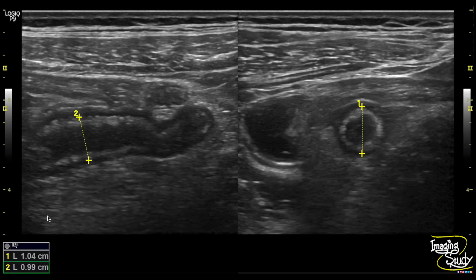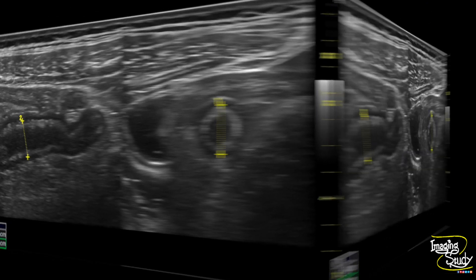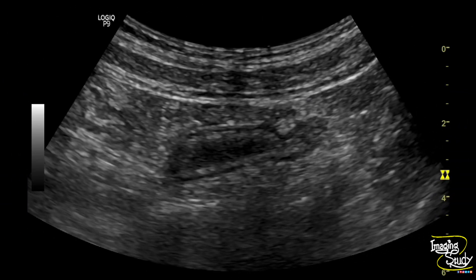Here is the measurement. It was non-compressible and the measurement was around 10 mm. Here is the curvilinear transducer view again — we can see the appendix here also.